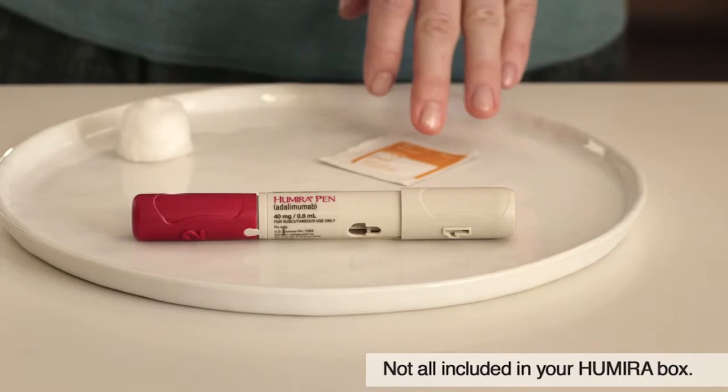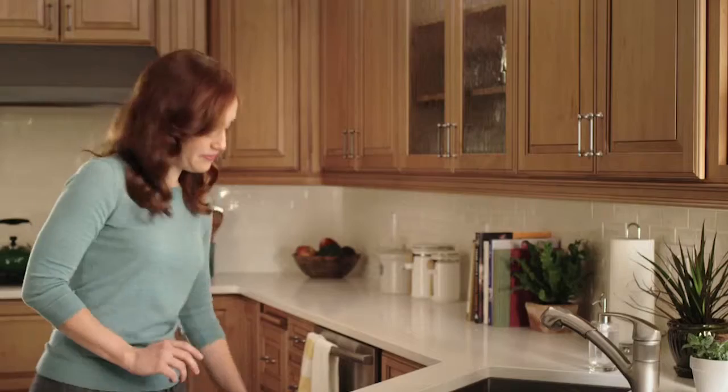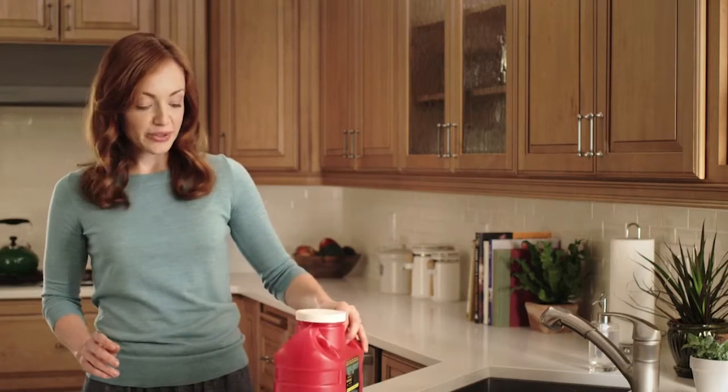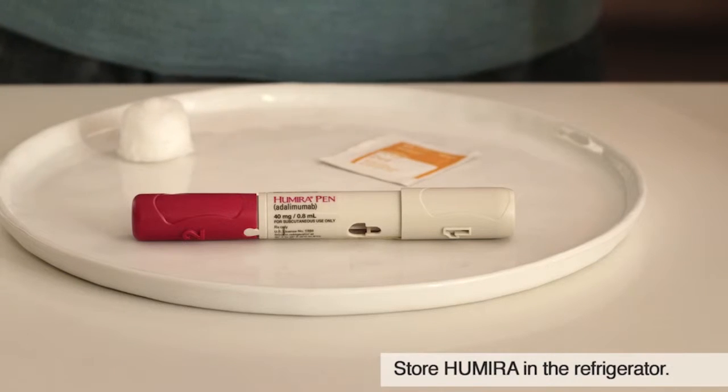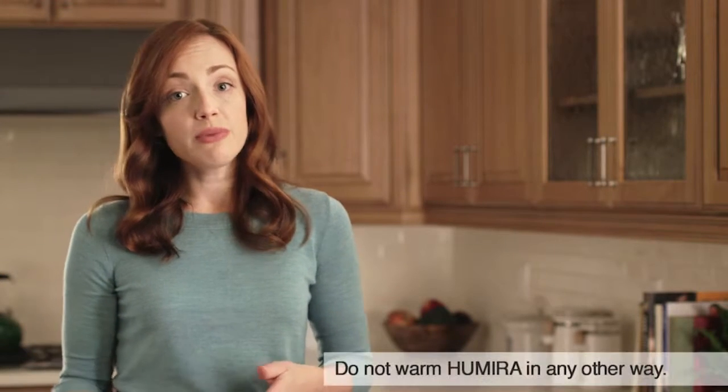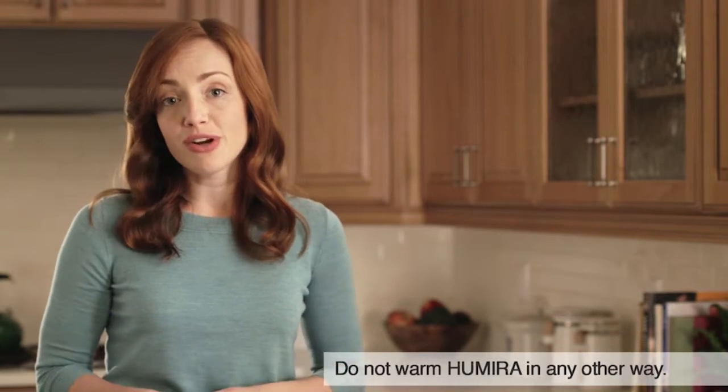After I wash my hands, I'll gather the items I need and place them on a clean, flat surface. I've got my alcohol swab, a cotton ball or gauze pad, a sharps container, and my Humira pen, which I've taken out of the refrigerator. If it's more comfortable for you, leave Humira at room temperature for 15 to 30 minutes before injecting. You'll want to do this in a well-lit place in your home where you feel relaxed and have some room.